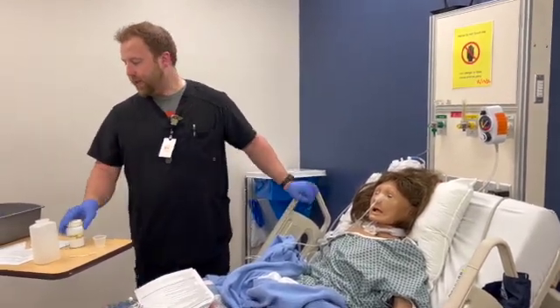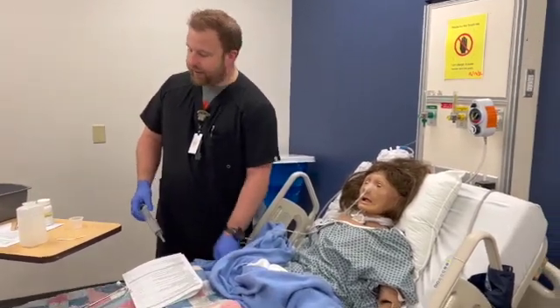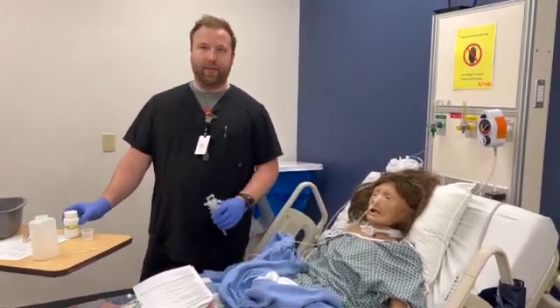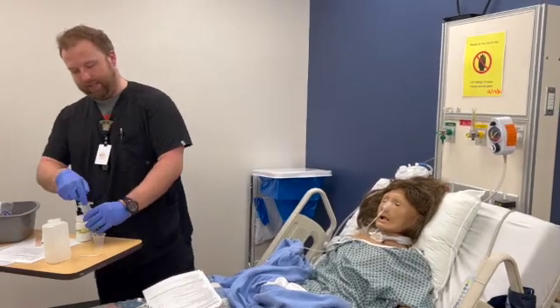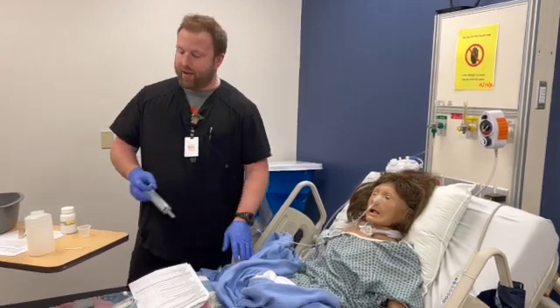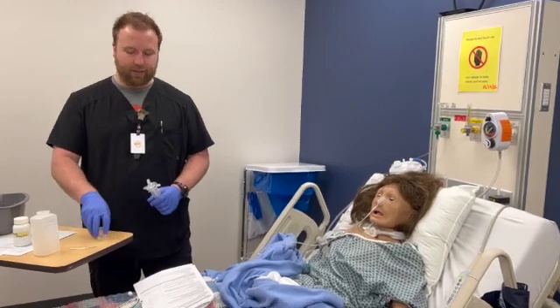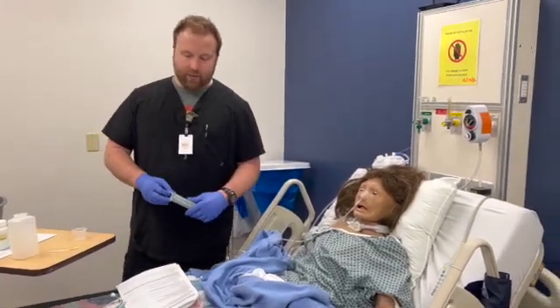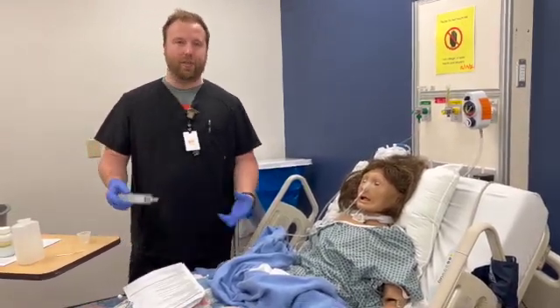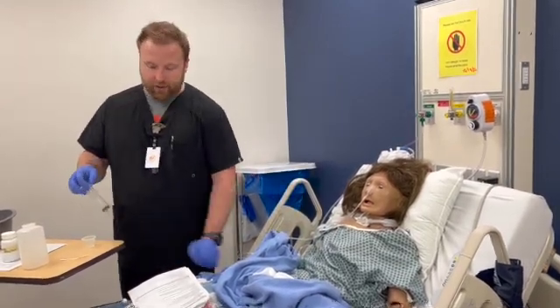I would have my medications out here, and when we do this, we'll have a pill crusher. You want to make sure if it's a liquid medication, not so much. You will give it, you'll flush, give the med, and we'll flush again. For your pills, if you have 2 pills, even on the same medication, you should separate those. It says crush one medication at a time. If you crush too many at a time, it causes a thick paste to go in and can clog off your tubes.